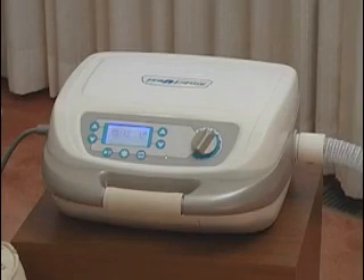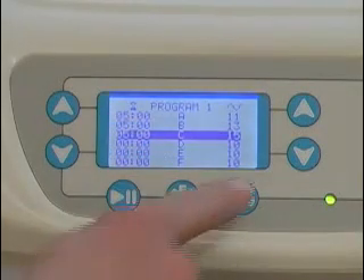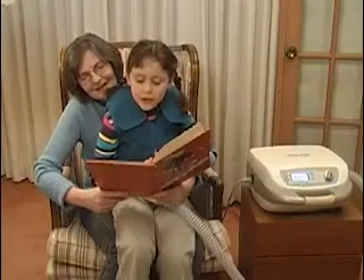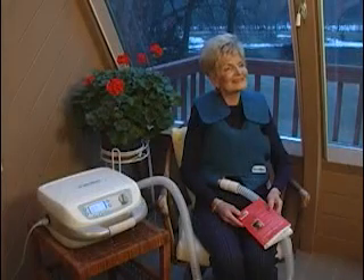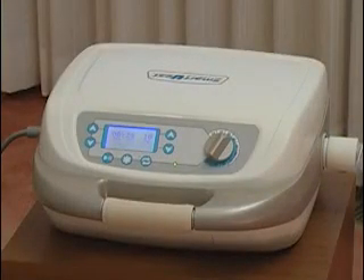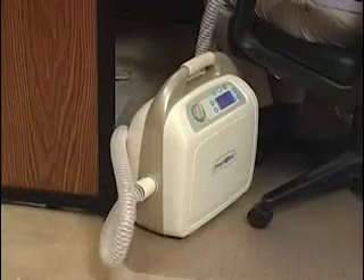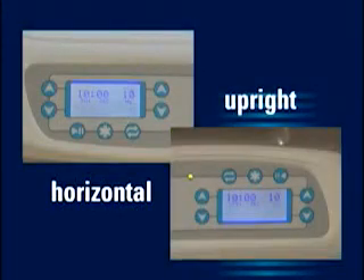The heart of the SmartVest Airway Clearance System is the Pulse Generator, which features a memory function that saves your individual treatment protocols. This allows most young children to use the device with minimal parental supervision and requires less attention from users to complete each treatment correctly. ElectroMed has also designed the SmartVest Generator so that you can operate it in a horizontal position or in an upright position, with both orientations always allowing you the same view of the display.